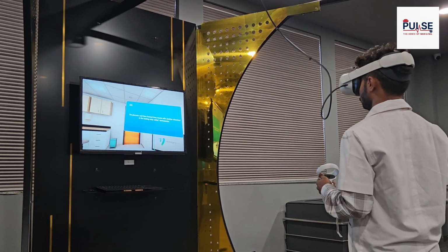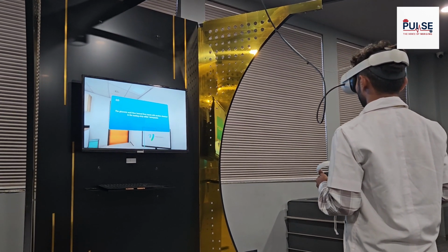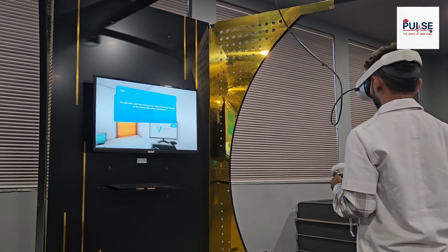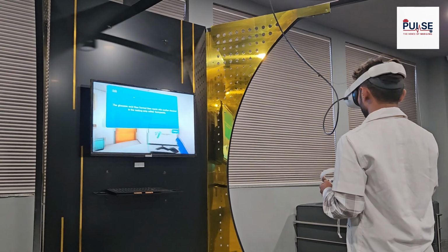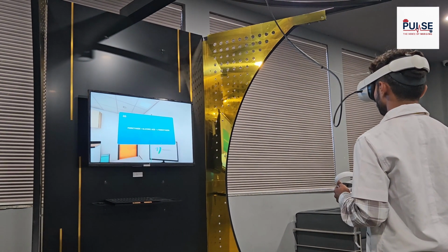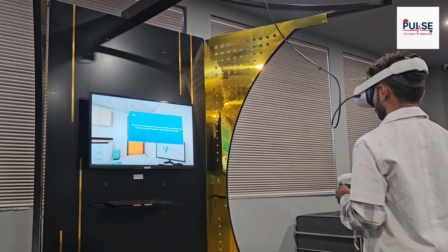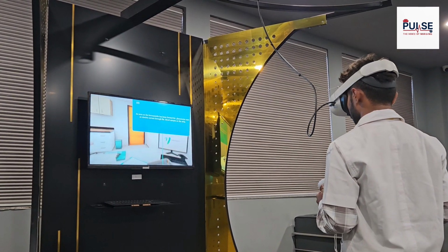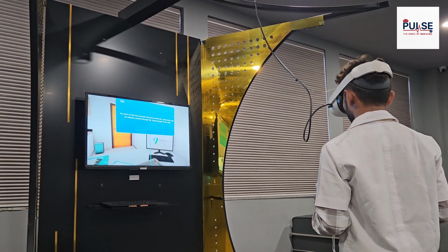The gluconic acid thus formed then reacts with another chemical in the testing strip called ferricyanide. Ferricyanide plus gluconic acid gives ferrocyanide. As soon as the ferrocyanide has been formed, the glucometer runs an electric current through the blood sample on the strip.